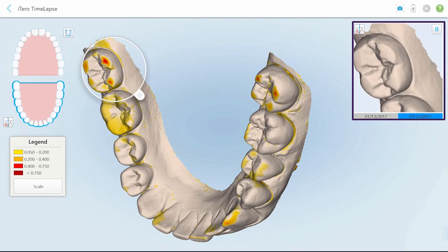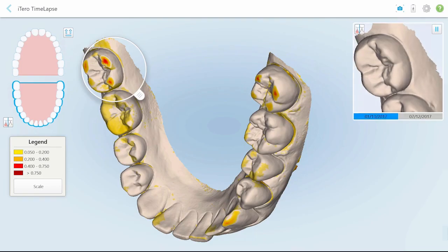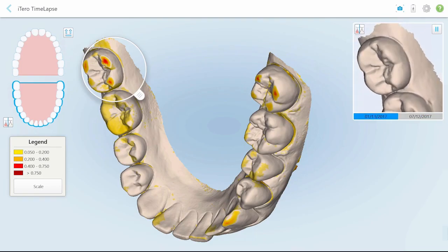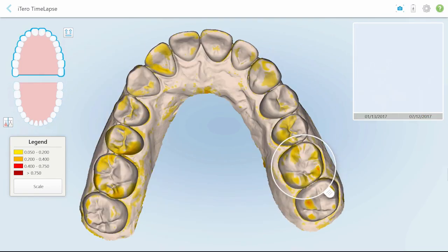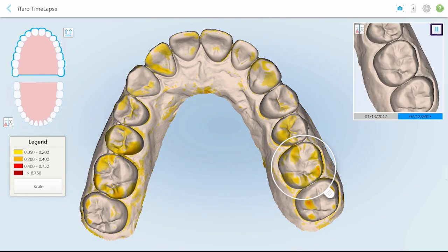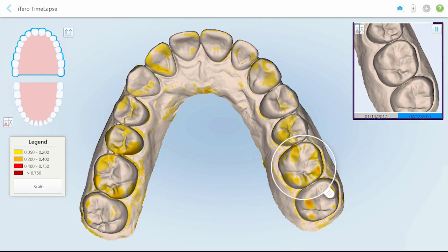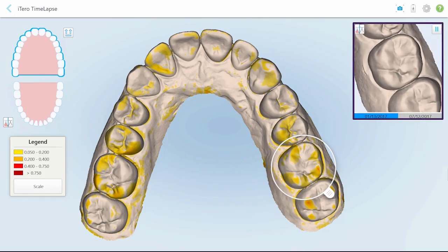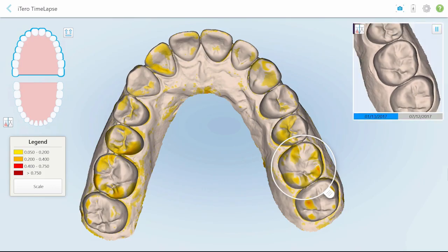Tooth wear can be easily observed by comparing the area in the two scans. Stop and continue the animation by tapping the pause and play button. Zoom in on the animation for a better view of the required area.